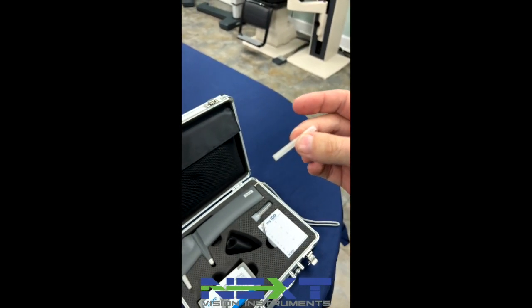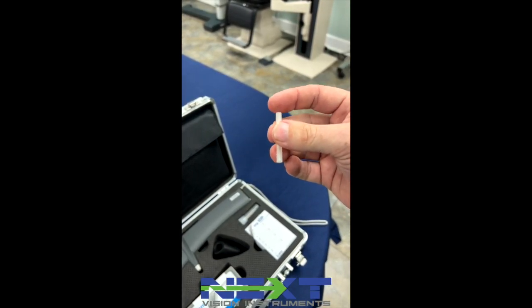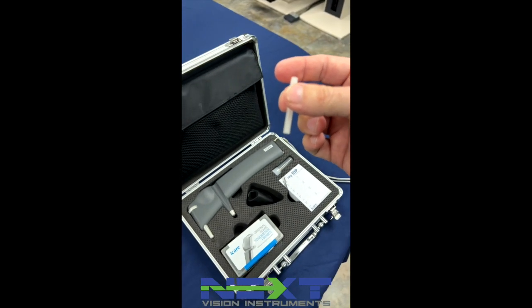After you have put the tip back into the case, you can throw this away. These are sterilized at first and disposable when you're finished.